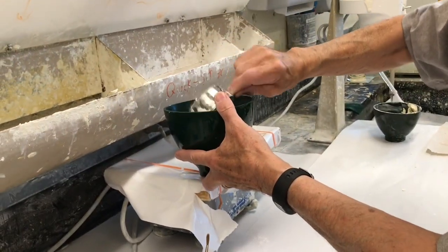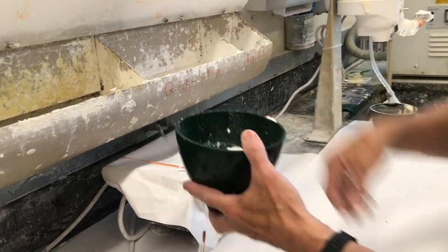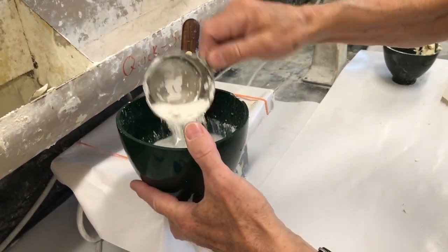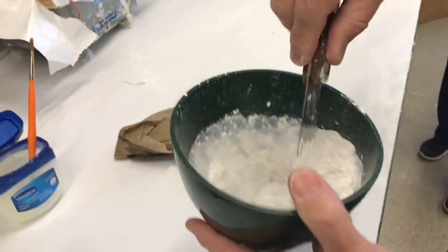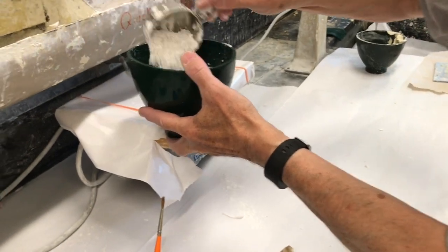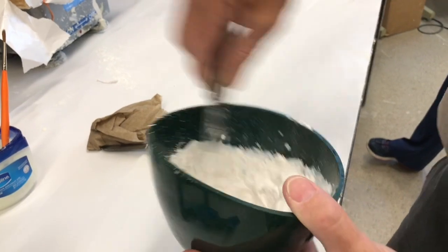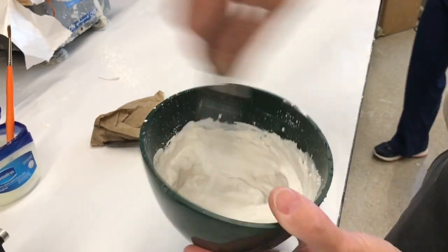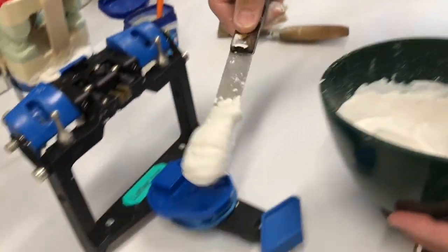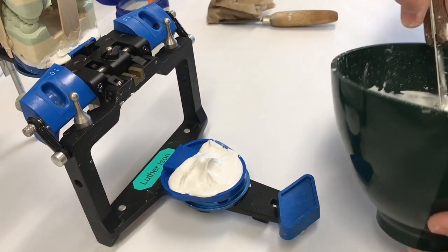I've got water in the bowl already. I'm back to Kwik-Set plaster, which is snow white number two impression plaster. It's made to set up — it's actually made for impressioning. Water in the bowl first, and I'm going to mix this so it's a little runnier than normal, not real thick. This Kwik-Set is going to reach initial set in maybe two to three minutes. So I'm going to mix it up fairly quickly. Apply it to the ring, making sure I get some underneath those little tabs on the sides and around that little button.